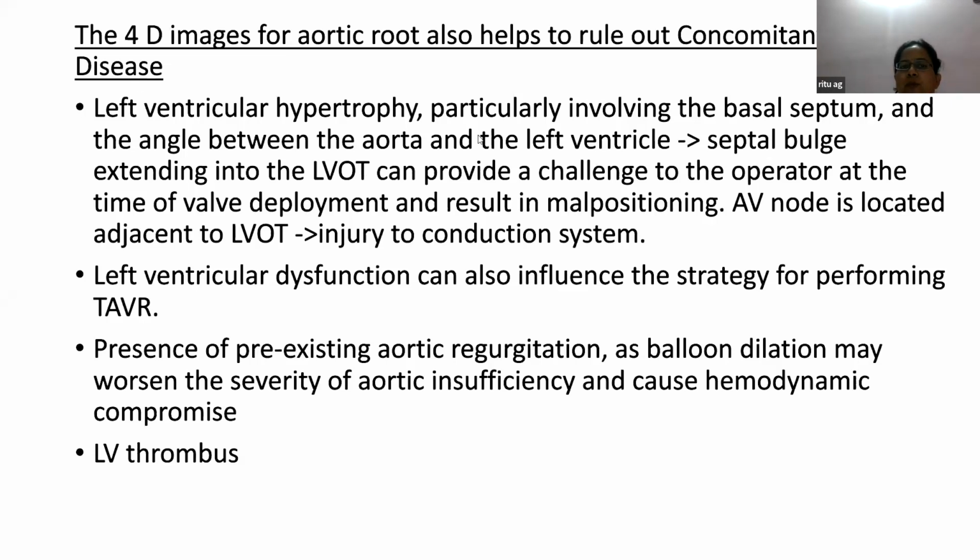Now, this LV hypertrophy is important because if there is a significant septal bulge into the LVOT, then it can be challenging for the operator to position the valve properly. And the AV node is also located somewhere close by, so we may have a possible injury to the conduction system.